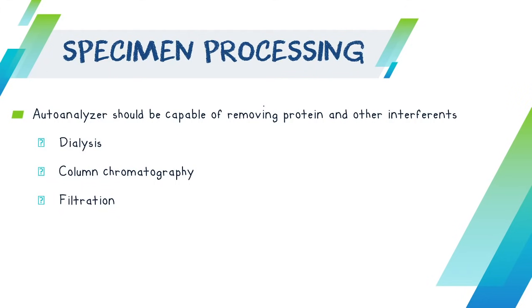Now, there are some tests, I don't know if this was pointed out in your lab, but if you noticed in your package inserts, there are pre-treatments done on your samples. And one reason you do pre-treatment is removing interference, so there are processes to do, like adding a reagent just to remove this interference.